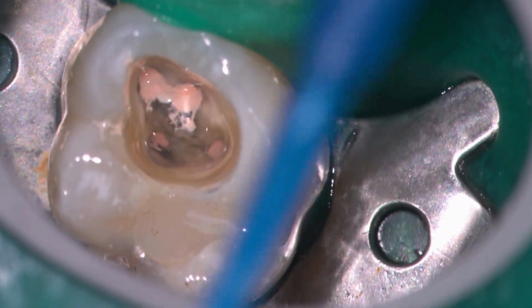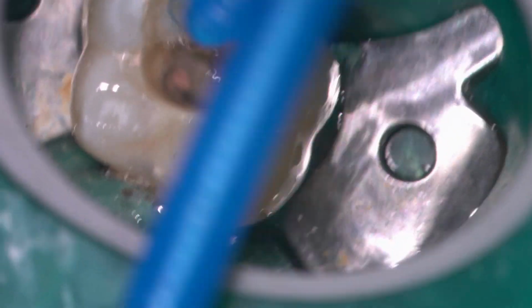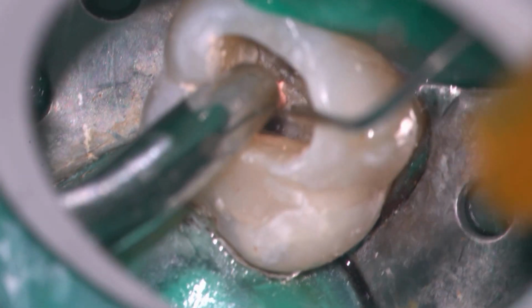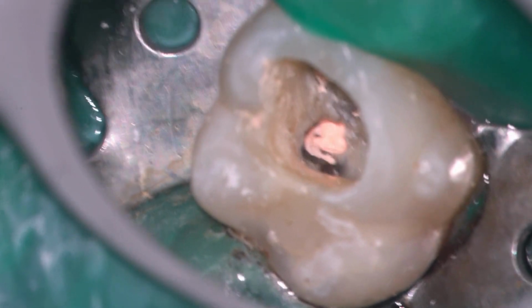And that'll give us a relatively clean wall and clean pulp chamber floor. And most importantly, I'm looking at the resorption crypt to make sure that it's clean and clear of any remnants of the gutta percha. So I'm still clearing with the alcohol. You can see there's a little stream of gutta percha there. We're going to pick that away.